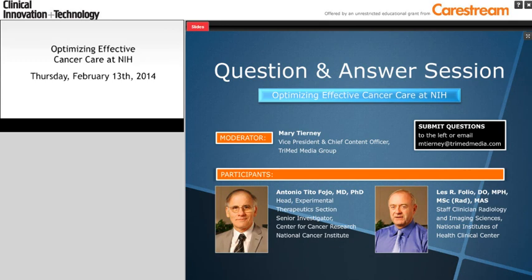They want to know, is there anything new that is dangerous? And then otherwise they want to know what's happening with those same lesions that I've been measuring over and over again. What pace of disease are we talking about here? So, it's remarkable. Dr. Folio, do you want to add to that?